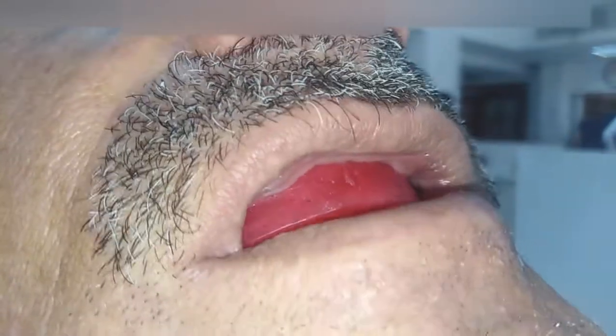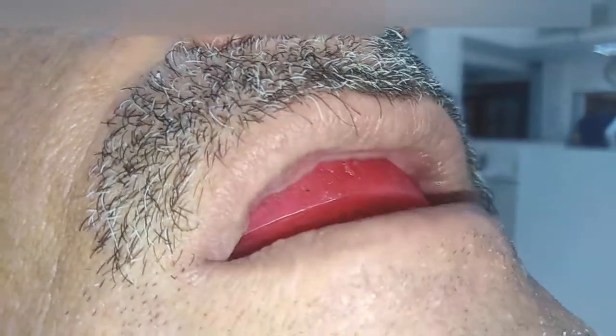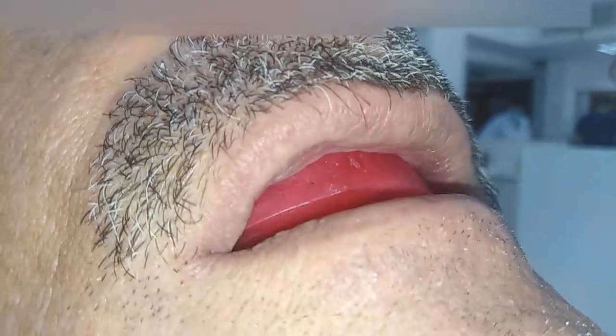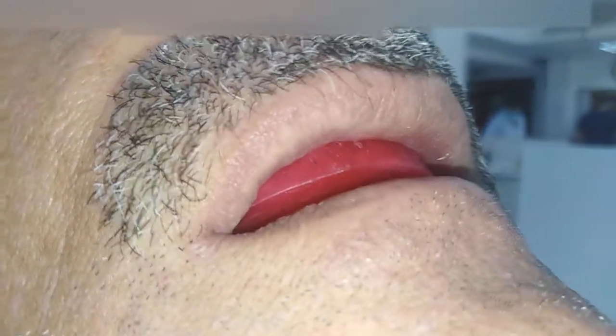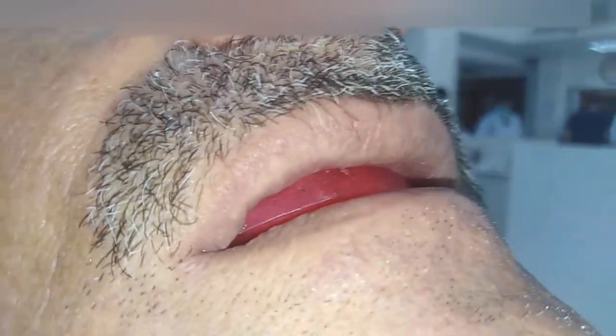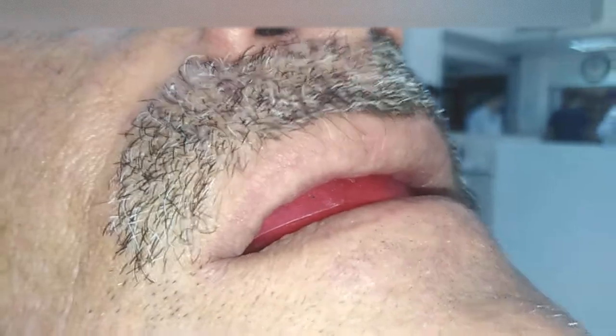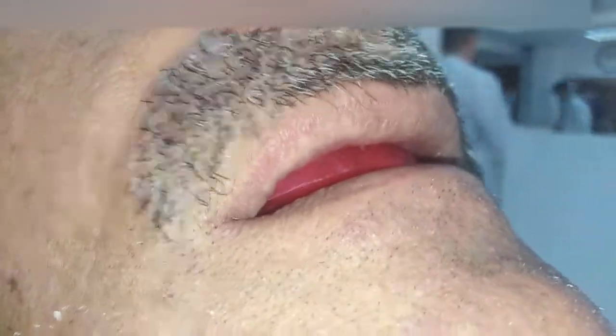See — the active lip is away. What's touching the wax is the flabby part of the ridge. So please differentiate between them, and you need to fill in the spaces.